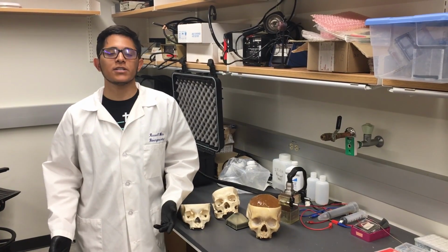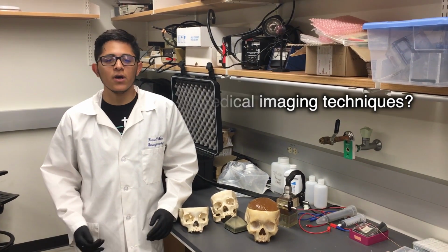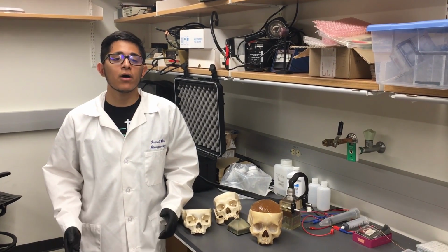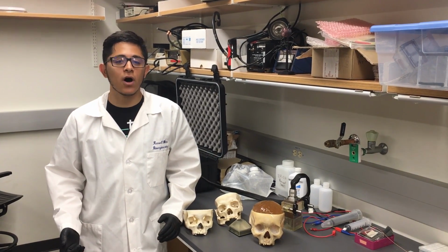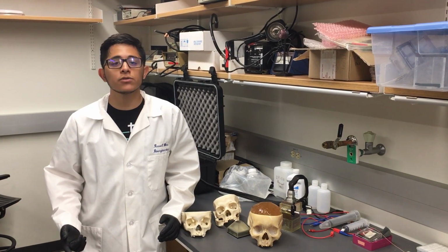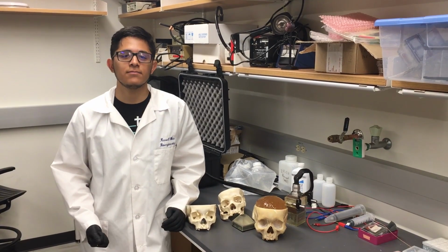Our lab's main question is, how can we use ultrasound to explore non-invasive medical imaging techniques? Currently, the highest resolution imaging technique used is functional MRI. However, the mode has an expensive cost, lack of availability to those with magnetic implants, promotes claustrophobia, and the time to receive results can take weeks.